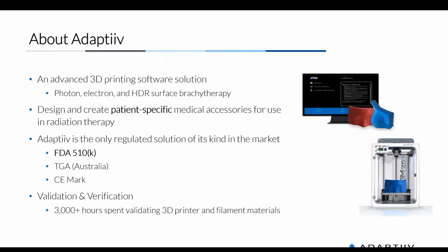Also regulated in Australia and all over Europe with our CE mark, as well as ISO certification. So we try to take as much of the legwork out of it as possible for you, the end user.